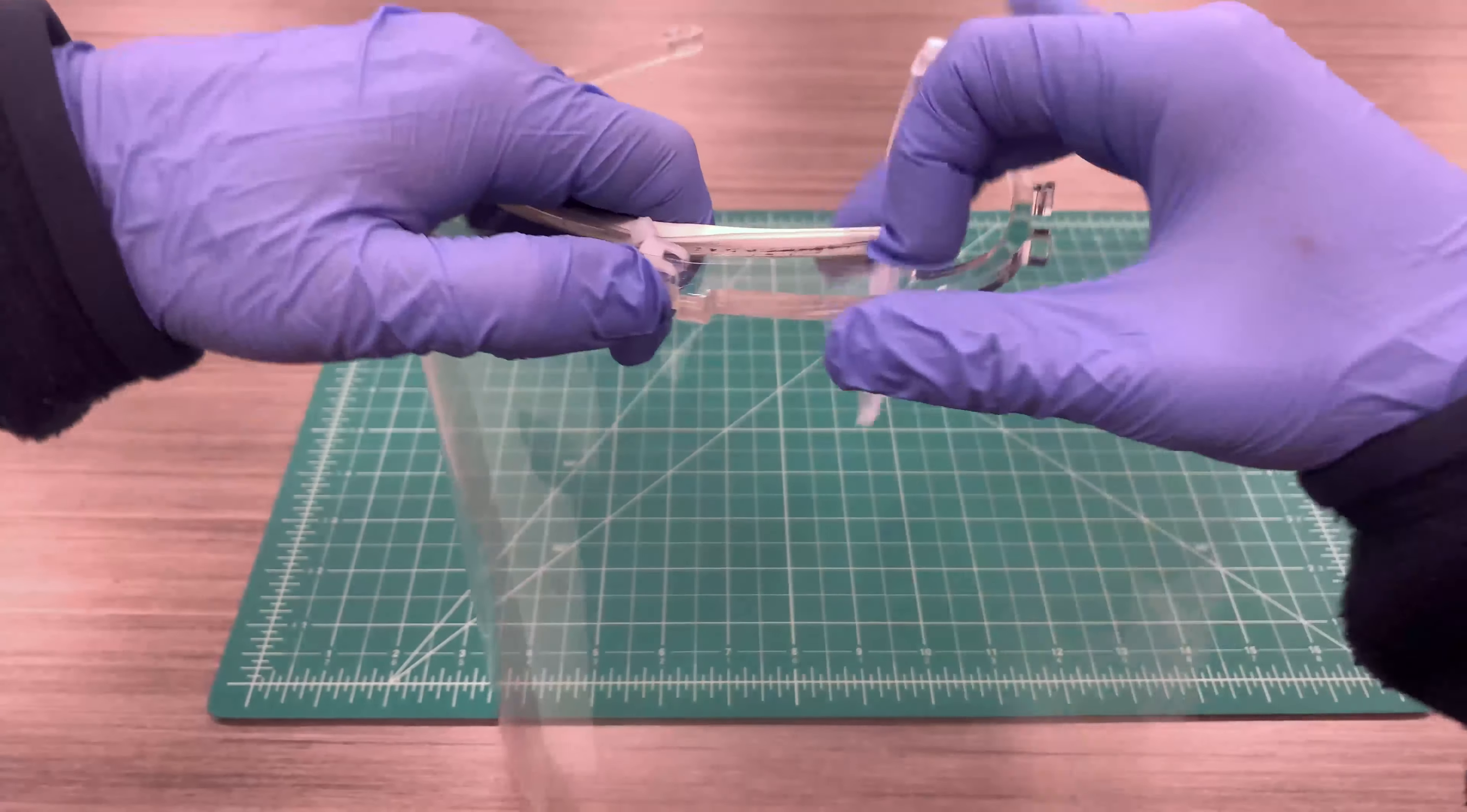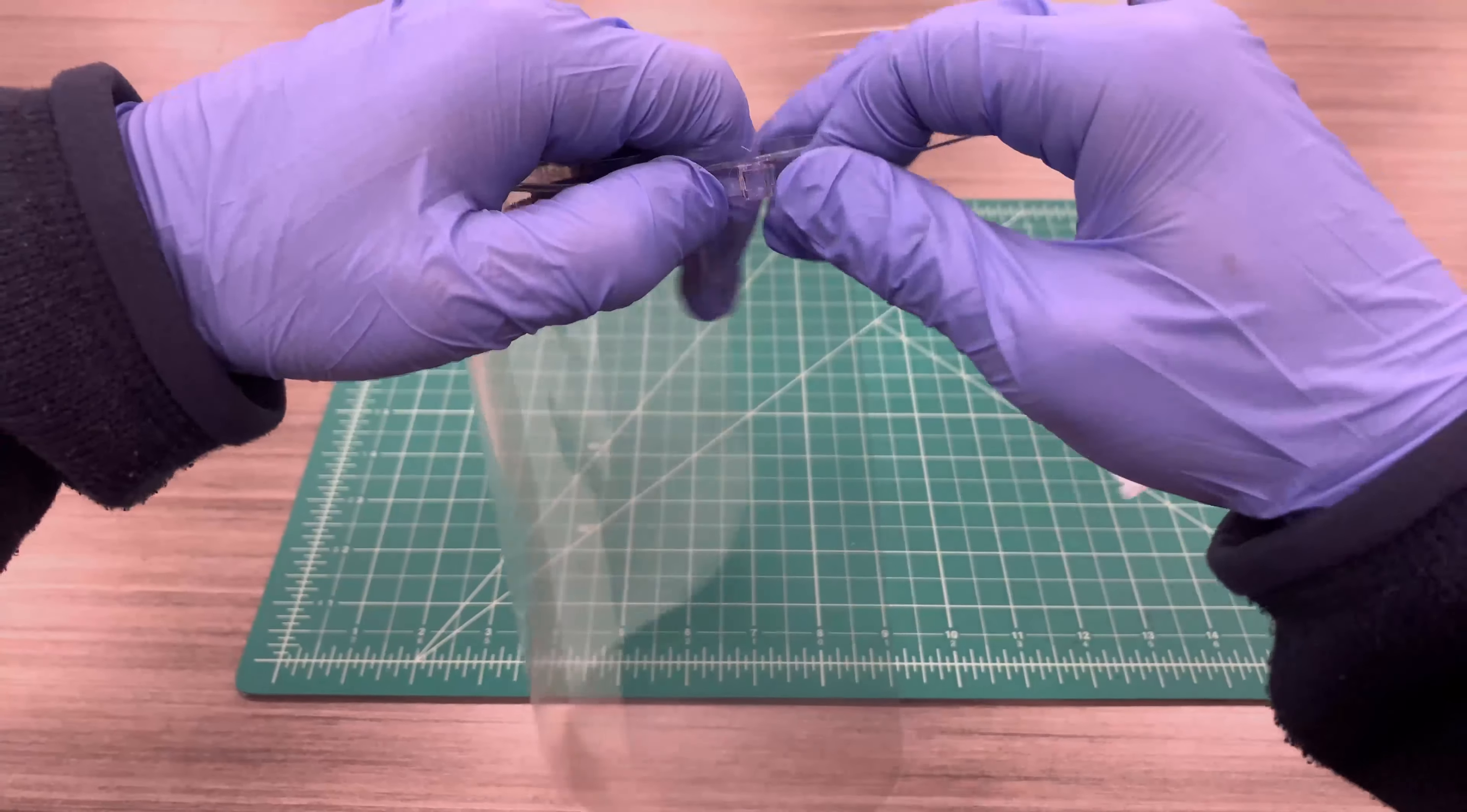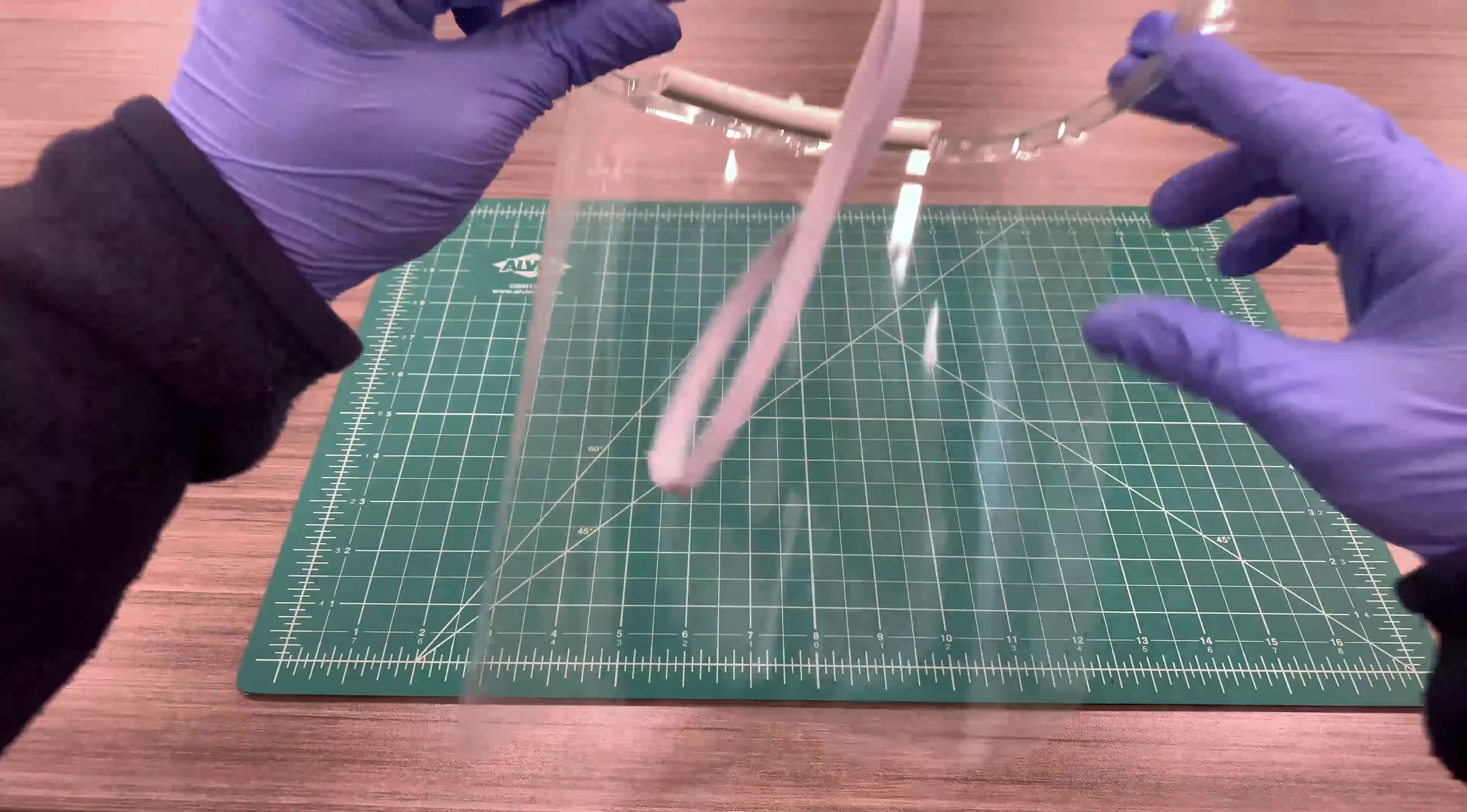Pop it on, move to the next one. And this last one's going to be the trickiest, but it's got a little bit of extra pop, and there you go. That's the completed face shield.